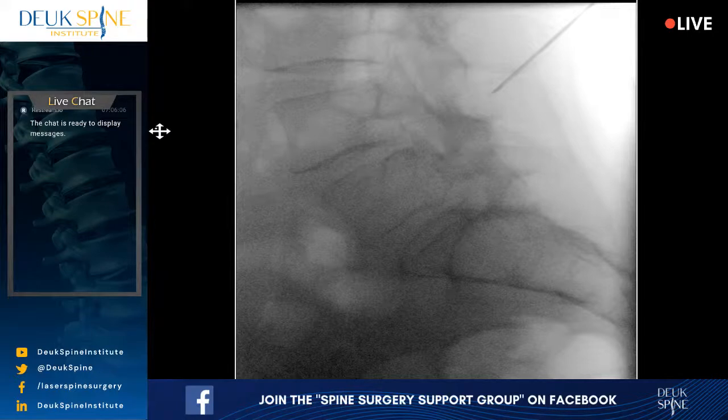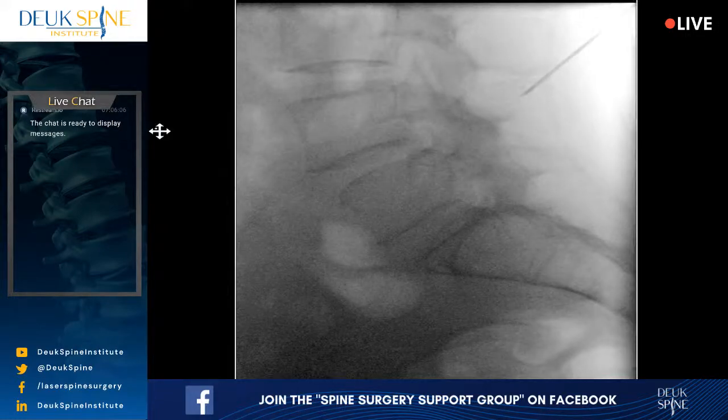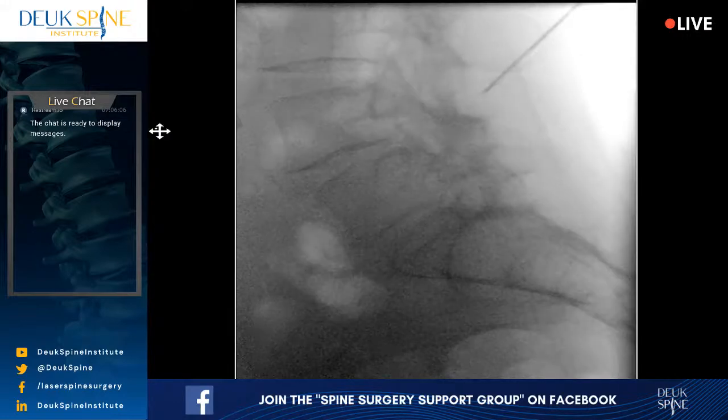So while Jordan is working on getting us lined up, if you don't line up properly through the spine, and you're at an angle, then your trajectory or path that you think is good could actually be very bad. You could be way off target.